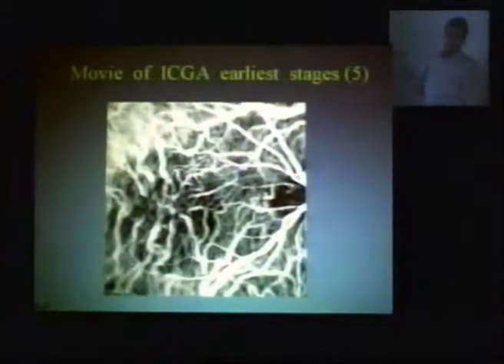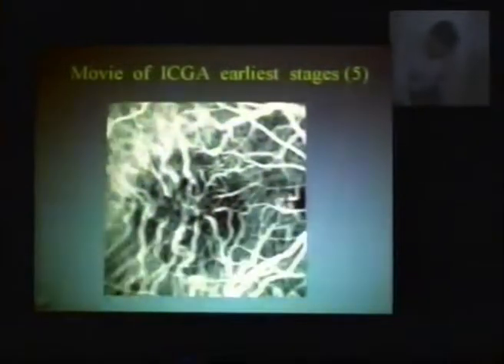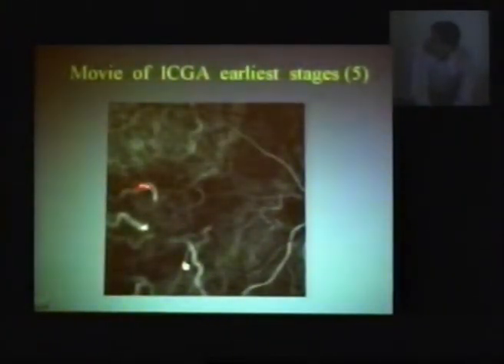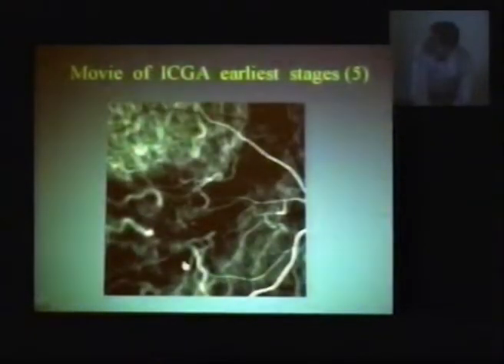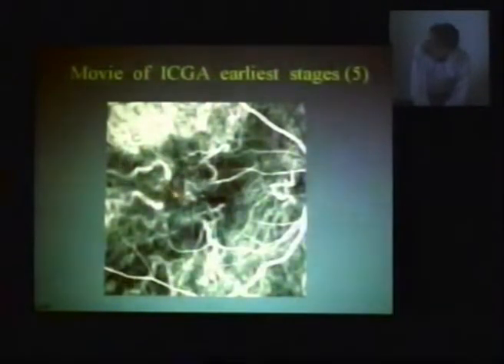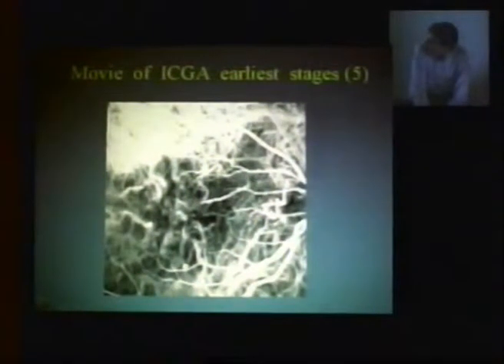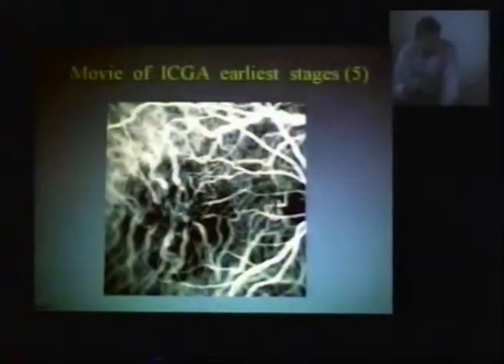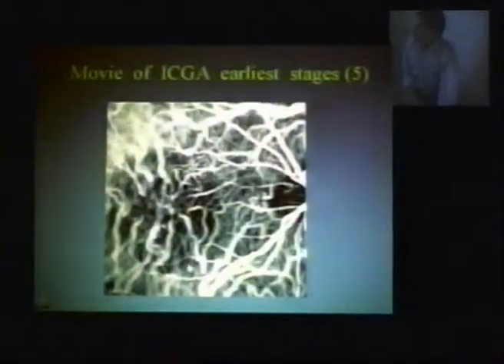See, now we cannot see anything, only the first few seconds. We do it again. Stop for a second, you see that vessel over there? That is the CNV, being fed from there and from there. And already now, it's getting to be very difficult. Now, impossible. So only the first few seconds. You have to sit and go stop, start, stop, start, and we find it.